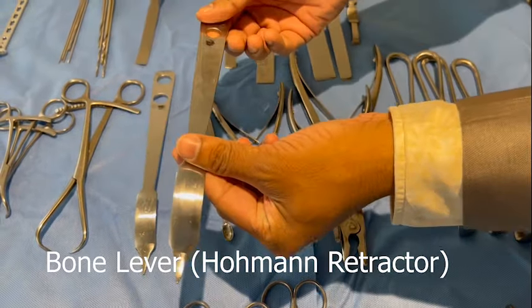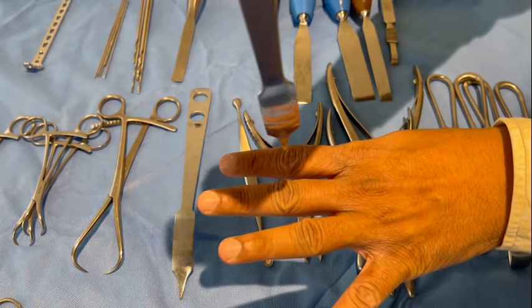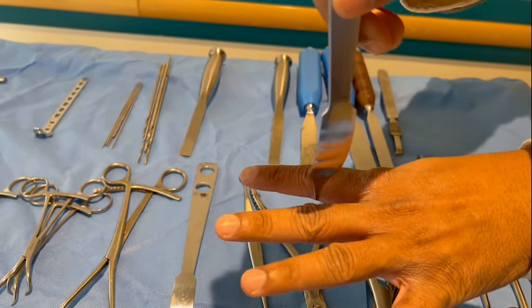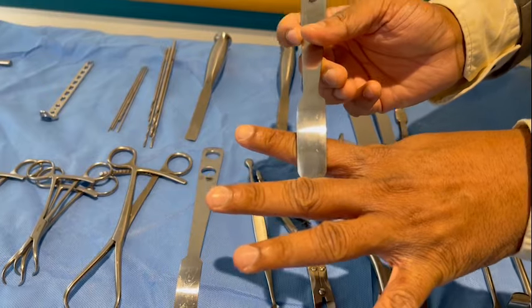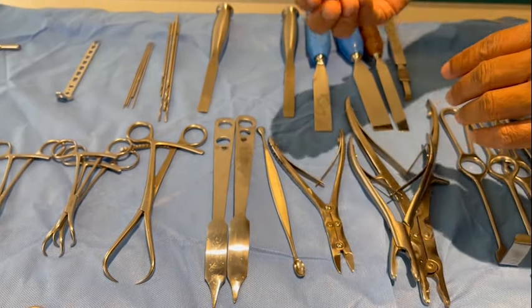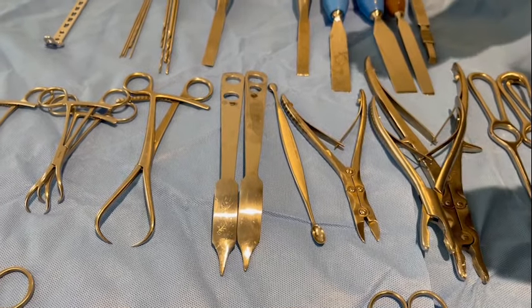This is a bone lever. It is used to move away tissues from the bone. After you make an incision on the periosteum and elevate the periosteum with the periosteum elevator, you slip the bone lever under the periosteum and remove the tissues away from the bone. That way you can expose the bone and make sure there are no major vessels or nerves under the bone before you use the bone lever. For example, in an anterolateral approach of the humerus, don't use the bone lever too deep — you could damage the radial nerve.